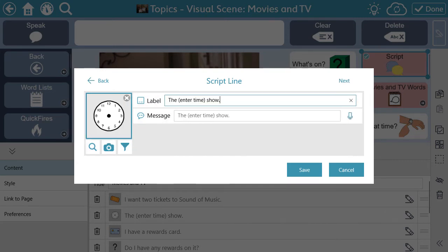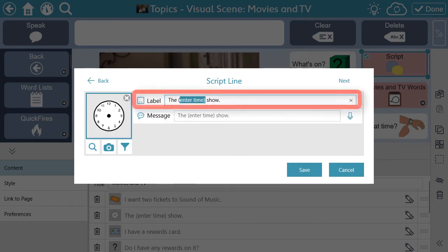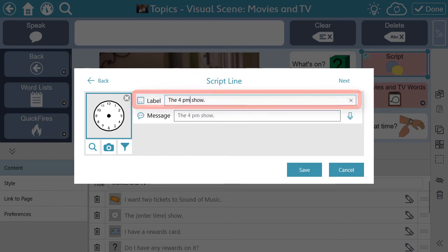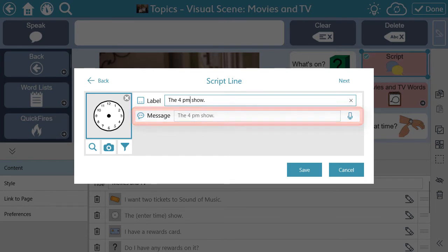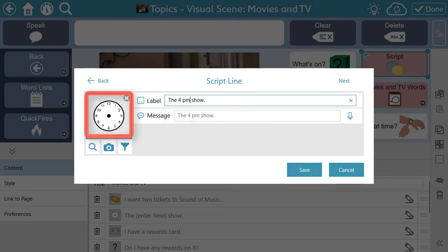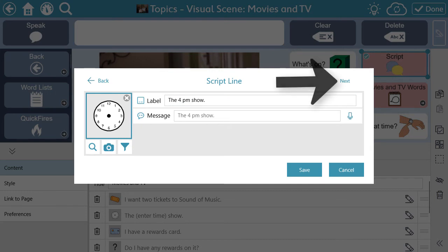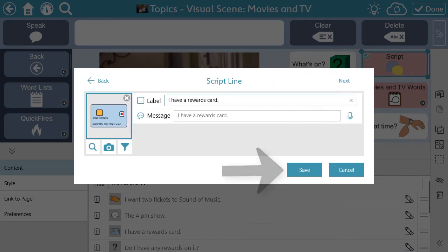For each line, you can write a label and what you want the button to say when selected, and you can choose an image. Advance to the next line in the script using Next, and when you're done, select Save.